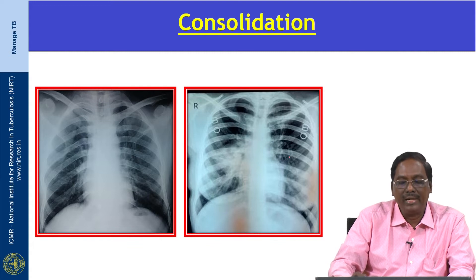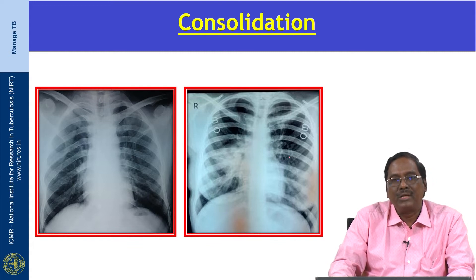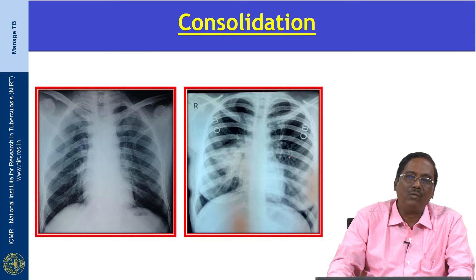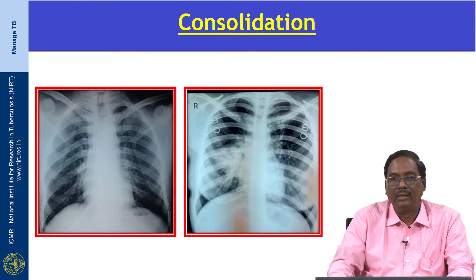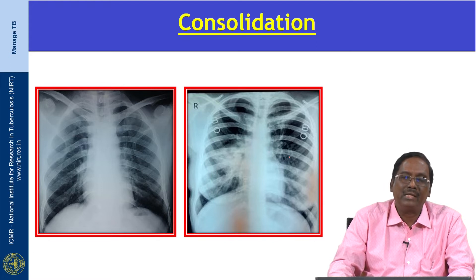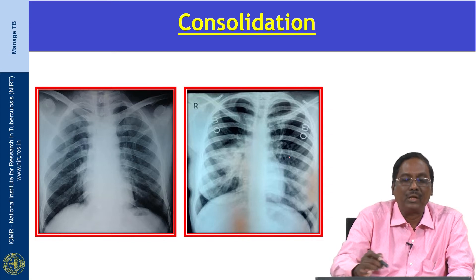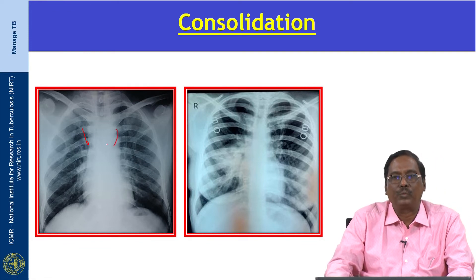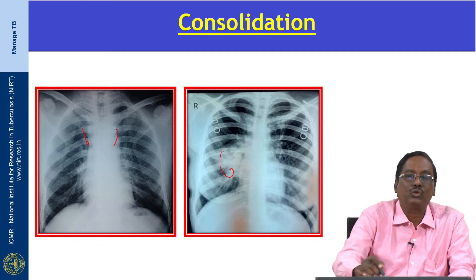In 5 percent of patients, the Ghon focus extends into other parts of the lung, usually in immunocompromised patients. Consolidation may involve a lobule, segment, or lobe. Primary consolidation usually involves the anterior segment of the upper lobe, middle lobe, or lower lobe, and may be associated with lymphadenopathy. That association is an important feature to differentiate consolidation in primary TB from post-primary. This image shows consolidation associated with lymph node enlargement.